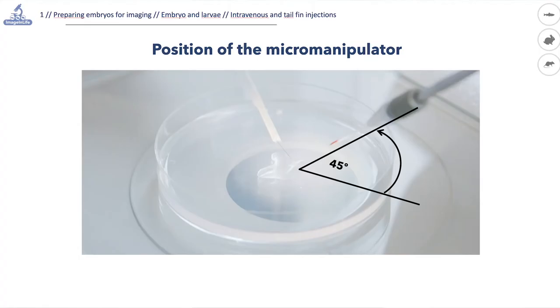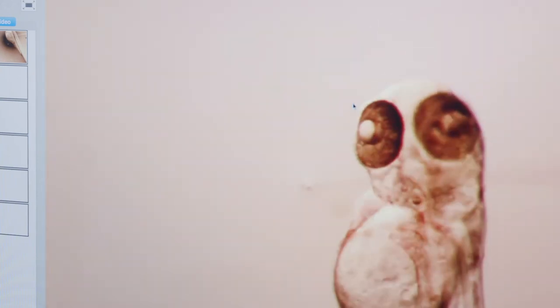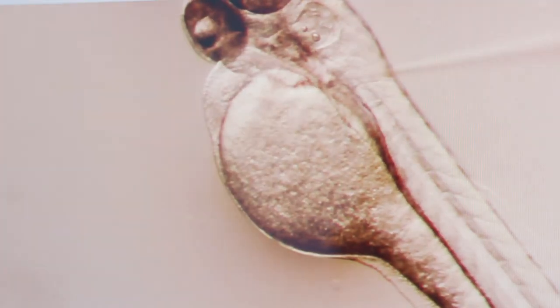Finally, we are ready to proceed with the injection. We adjust the position of the micromanipulator at a 45-degree angle between the needle and the agarose plate. In this way, the site of injection is approached from above. An easy way to confirm if the injection was performed correctly is to check for the immediate expansion of the duct of Couvier after the pulse. Also, there should be no change in the yolk structure.